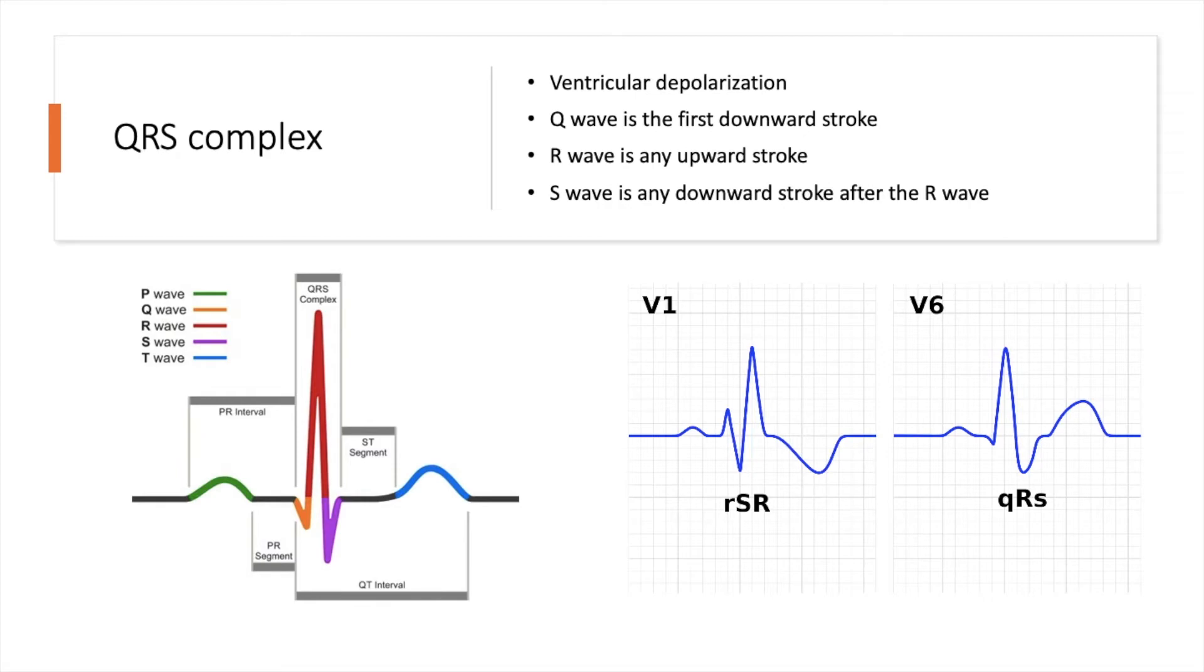Sometimes you might be asked to name a QRS complex or identify the pattern that's associated with it. If we just go back to our main principles, you can see that the first upward stroke is an R. So this is going to be an R wave. The S wave is any downward stroke after the R wave. So this is going to be the S wave part. And then remember that R wave is any upward stroke, so finishing off with an R pattern. So this is actually called an RSR pattern, rather than the normal QRS complex. And because the Q wave is the first downward stroke, but you don't actually have any downward strokes that happen initially, there is actually no Q component to this. This is characteristic of a particular ECG pattern, but I won't talk about that too much now.